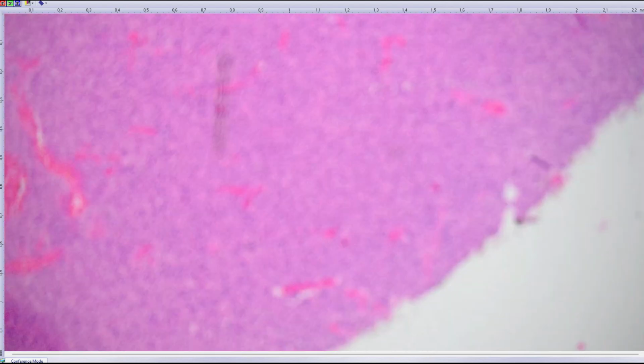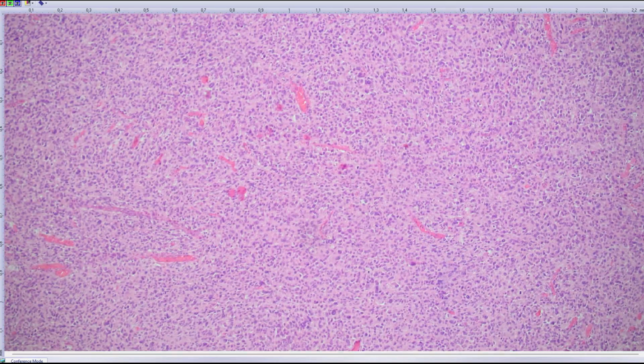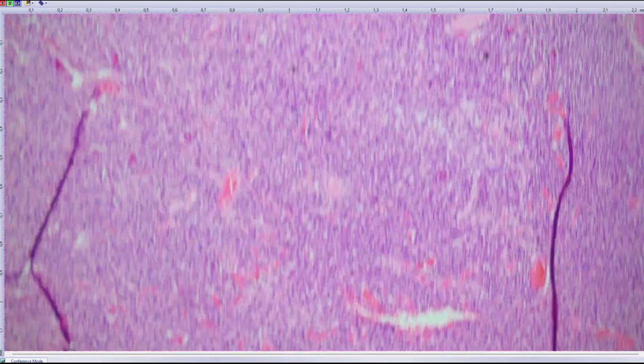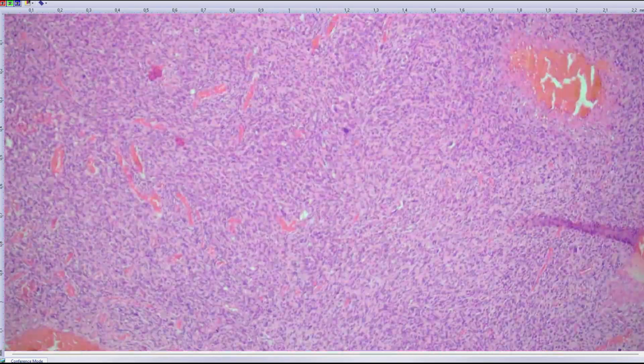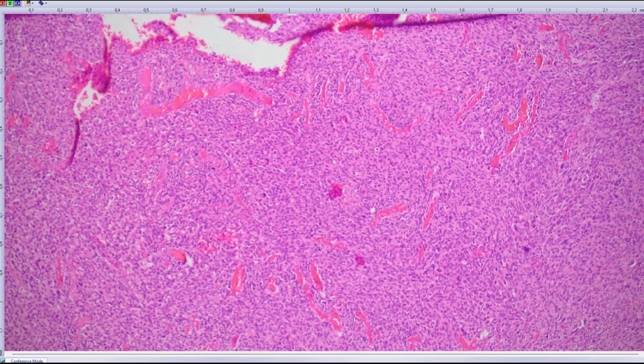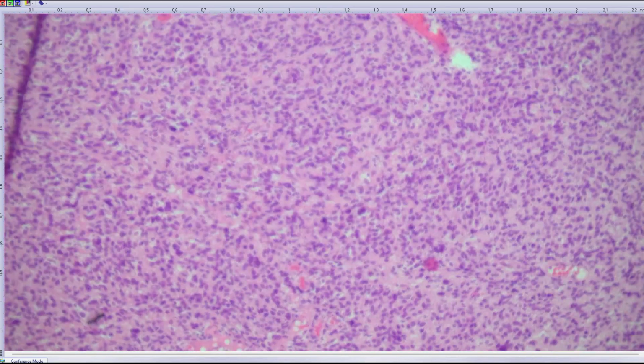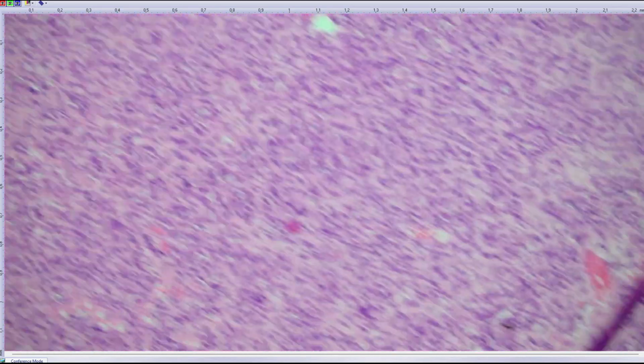I'll try one more slide. This was a several centimeter large tumor, so we had a good sample. So this is some poorly differentiated neoplasm. Based on morphology, you can exclude anything hematological, I think. It's very unlikely. And you are stuck with some sarcoma or definitely melanoma.